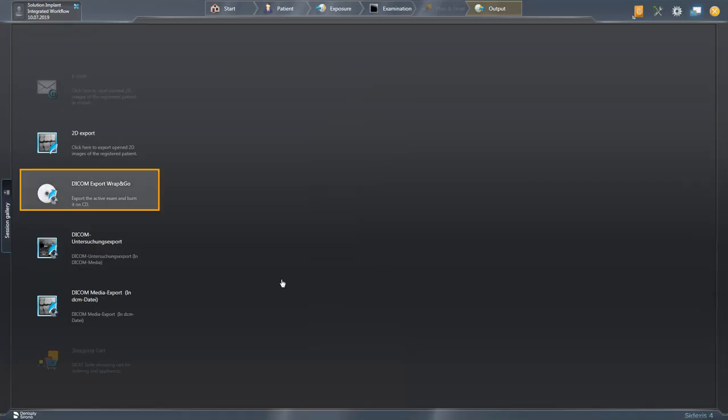Next, we come to the DICOM Export Wrap and Go option. With this option, the active examinations including the Sidexis 4 viewer can be automatically exported and burned to DVD or forwarded to your data system. All media items of the currently logged in patient that were opened in the examination phase are exported in a format compatible with DICOM and a setup for the Sidexis 4 viewer is added.